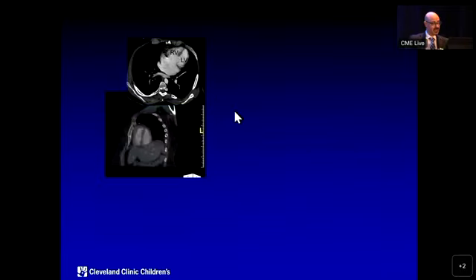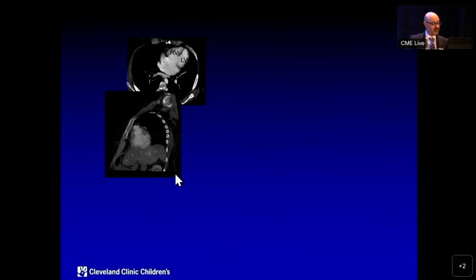So this is just some selections from his CT, how we began to think about him. This is a modified axial view that showed the ventricular looping, and it shows you that the ventricular volumes were reasonably good and balanced. This is the RV, his LV. This is a short axis view that showed the septum smack in the middle, again balanced ventricles. And then a more basilar cut to show in planimetry the orifice of the AV valve, and how the AV valve orifice suggested that it is equally committed to both ventricles.